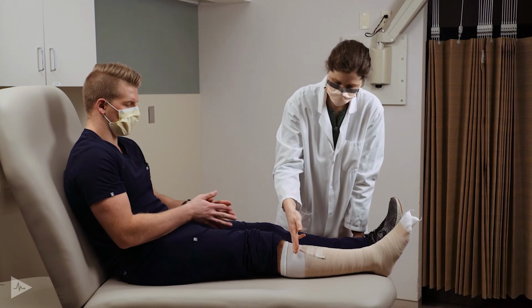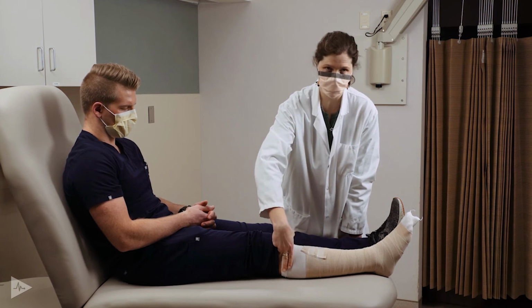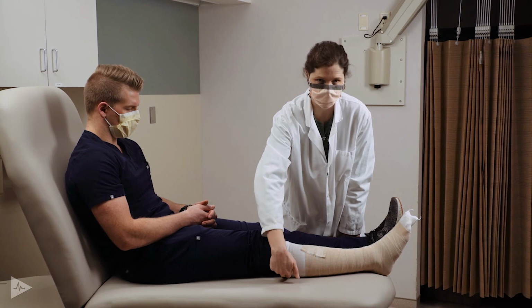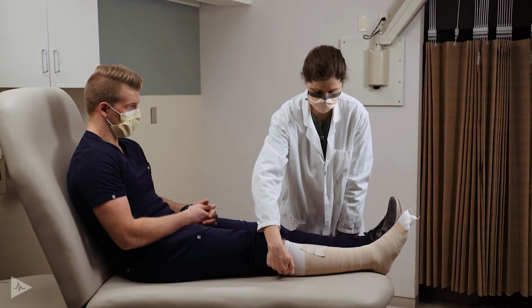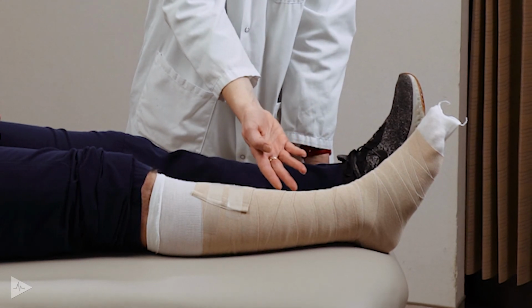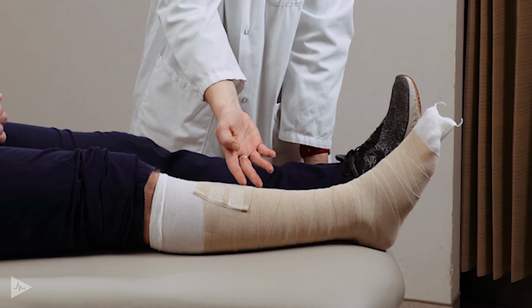Ideally, we want to bring the compression up to just below the knee. For wraps and stockings, you want to try to stay about 2 finger widths below the back of the knee. We don't want compression to come into that popliteal fossa and cause any irritation to the patient. So if you want to take a closer look here, we have that nice crisscross figure of 8 pattern going up the leg with the compression.